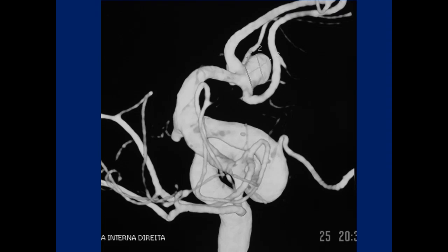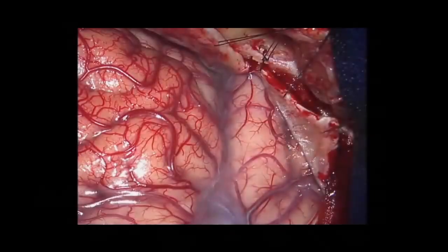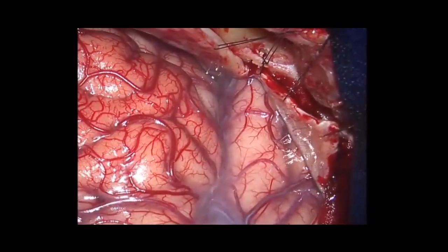This is the 3D reconstruction of the angiography. And here this is A1, and then A2, A2, and the aneurysm is right in the middle. Let's go to the video. This patient underwent right pterional approach.